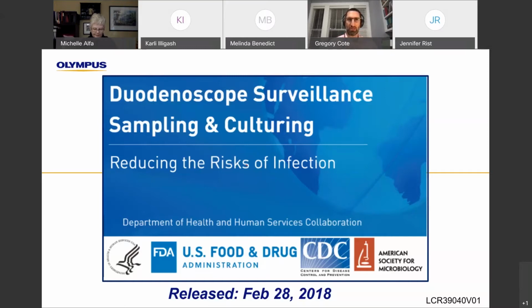But to have this be a regular part of your program on a weekly basis is, at this point, impractical. Hopefully, we will find that something like ATP testing or one of these other newer rapid tests that Michelle mentioned will be recognized as a surrogate, as an equivalent to a full-blown culture process. And then at that point, you could imagine it would be more practical to apply it, again, still as a quality check on your reprocessing program.